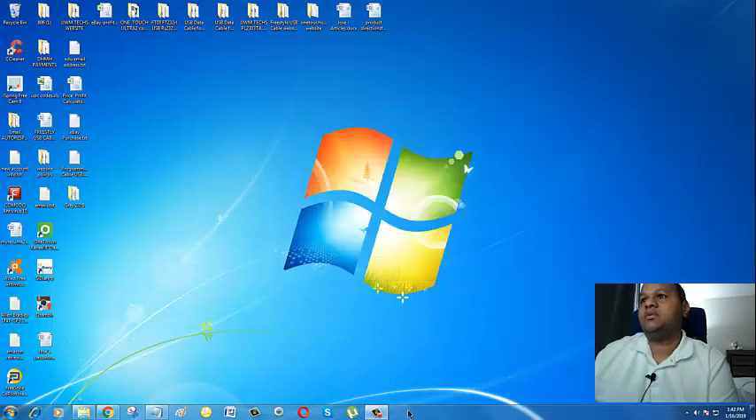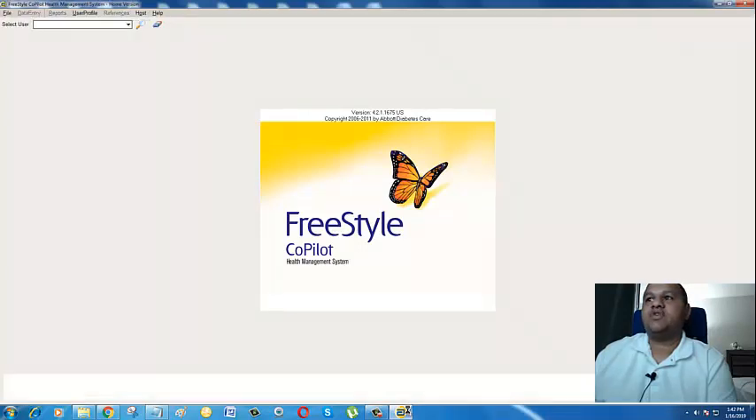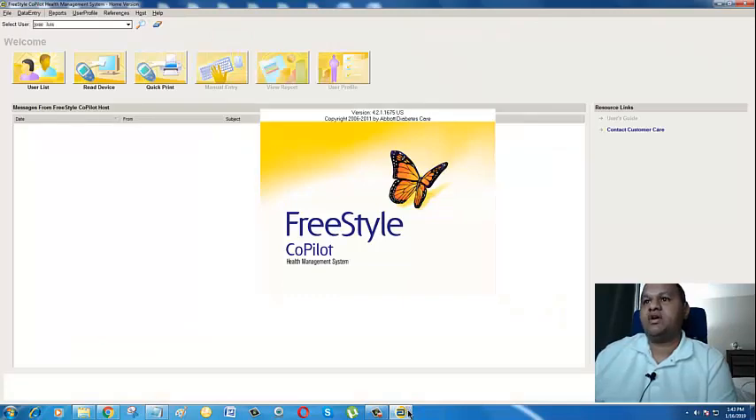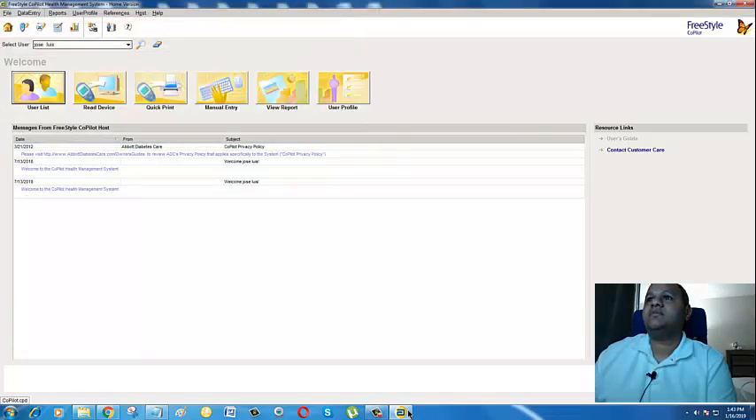Once you download the setup, I also want you to download the USB data cable driver — click here to download that one. I won't download it now because I already have it on my computer and I don't want to mess up the video. Go ahead and download it, install the driver — you'll go to your downloads folder, click on the driver file, and it will self-install. In the meantime I'm going to click on the setup to install the software, then minimize and close some things for a better view.